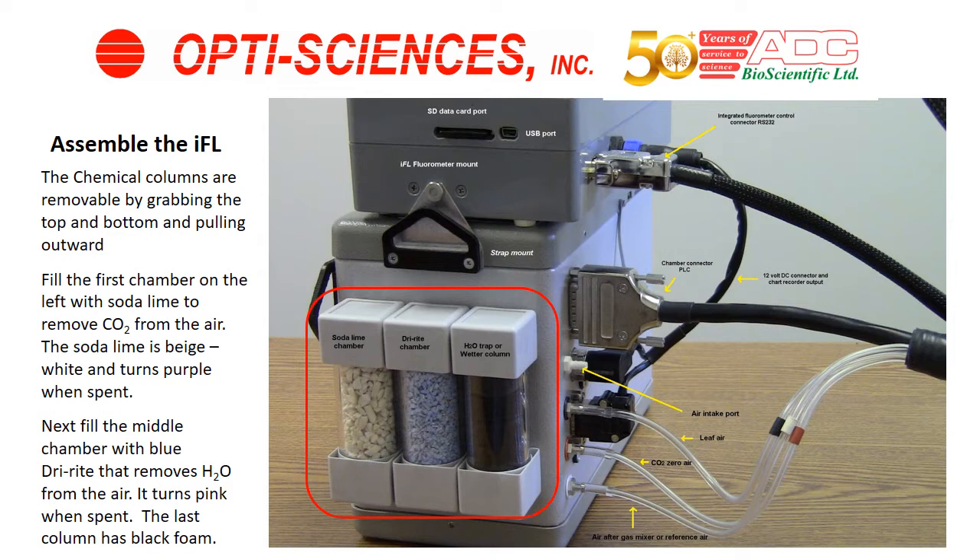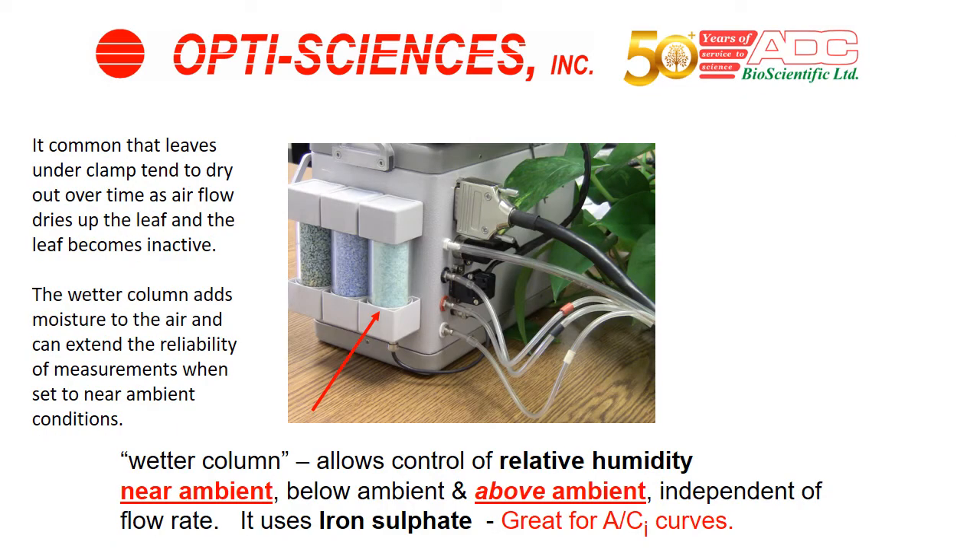Put the chemicals in place with sodalime on the left, dry-rite in the center, and the foam chamber on the right. ADC Bioscientific has something they call the wetter column, which is not something other companies offer. It allows you to make measurements with humidity levels above ambient, not just below or at ambient. You can set H2O levels near ambient to prevent the chamber and the leaf from becoming inactive. Above the color-coded clear cables you have a white port for air going into the measuring chamber.